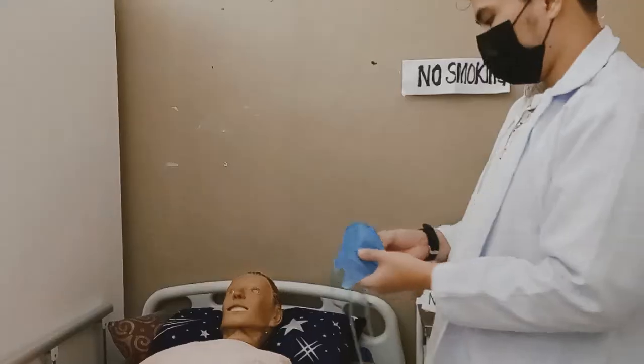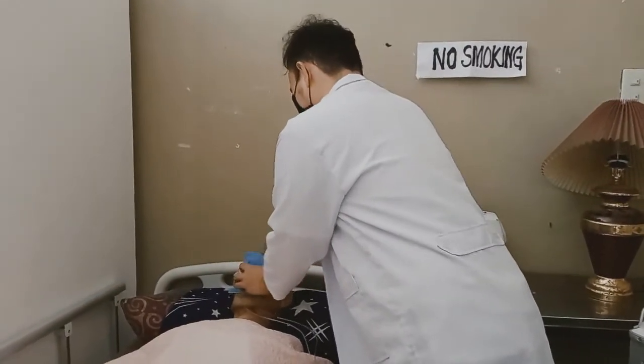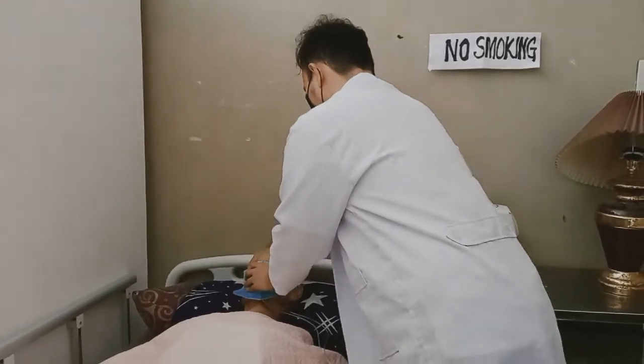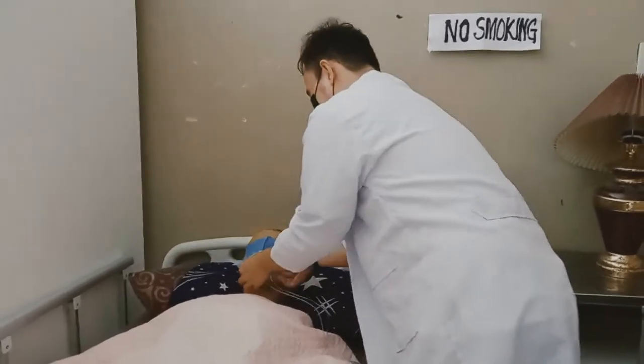Remove the nebulizer and open it. Place the patient's medication in the medication section of the cap and attach the rubber tube. Screw the top portion of the nebulizer cap back in place and attach the cap to the nebulizer.